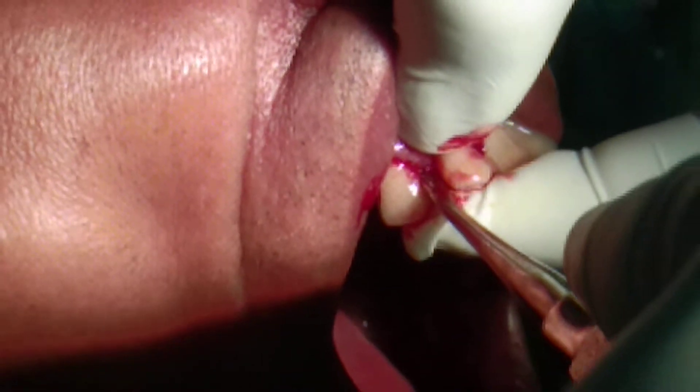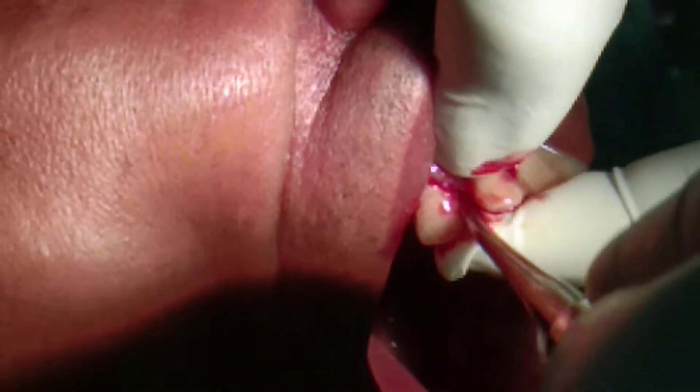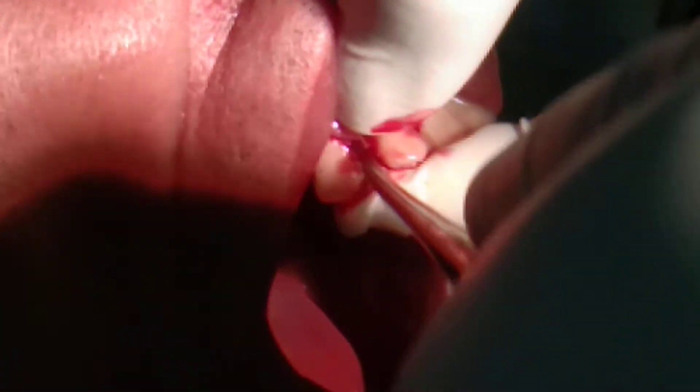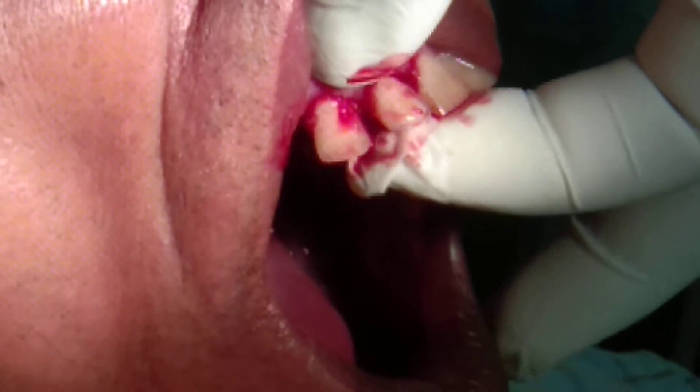So this is what I am going to do now. Take the leverage from the interdental bone, not from the adjacent tooth. Here I can take it from the adjacent tooth because here I also need to extract this one.